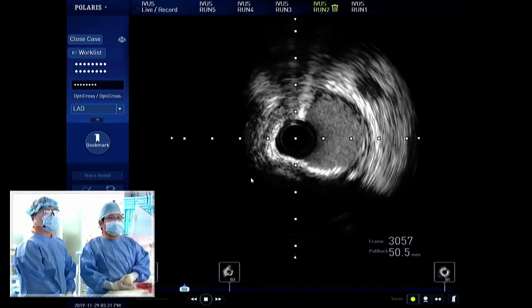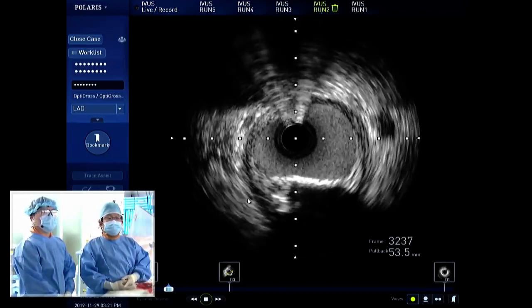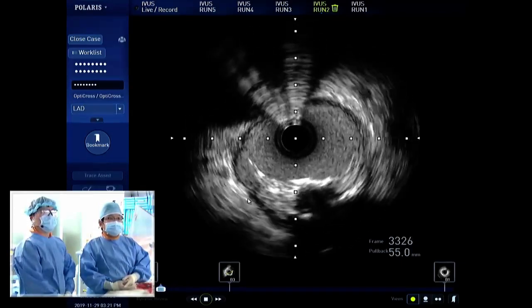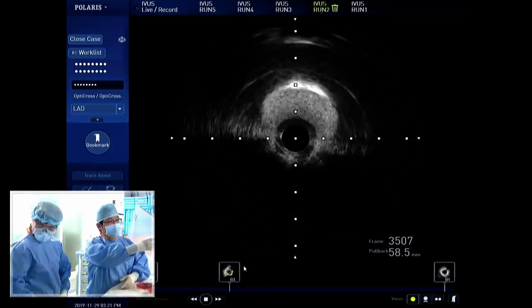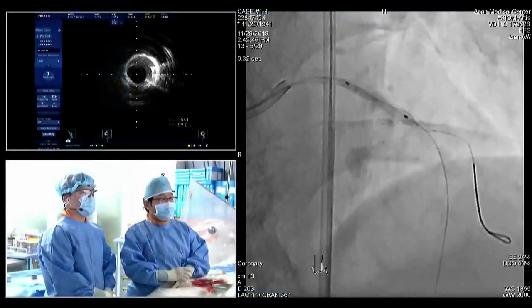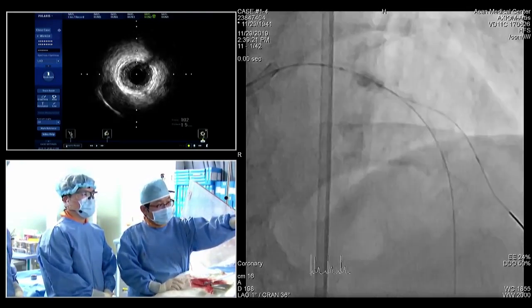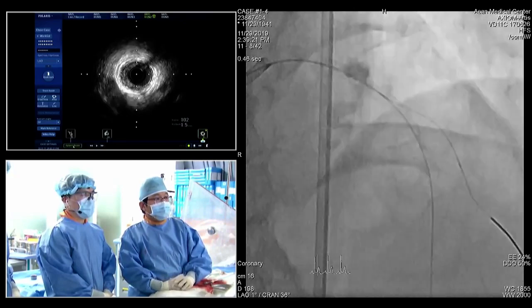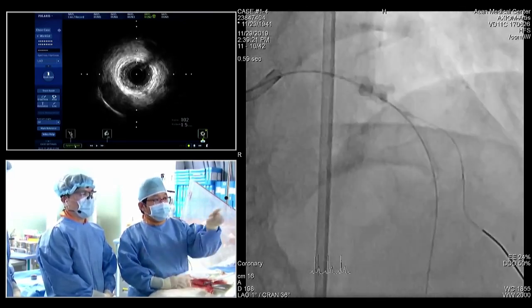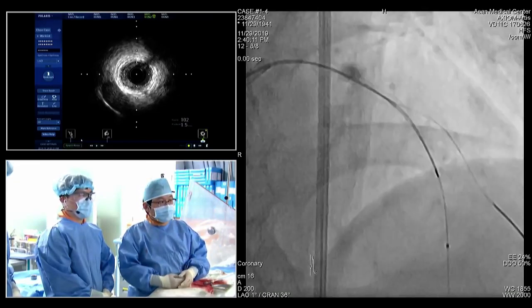So, okay. Here is your left main. Not bad. Okay, stop. Previously, I started at the point of, can you see the mid LAD normal looking area? So I would like to implant the stent from the mid LAD below the diagonal branch, and then I apply the high pressure again. Next, please.